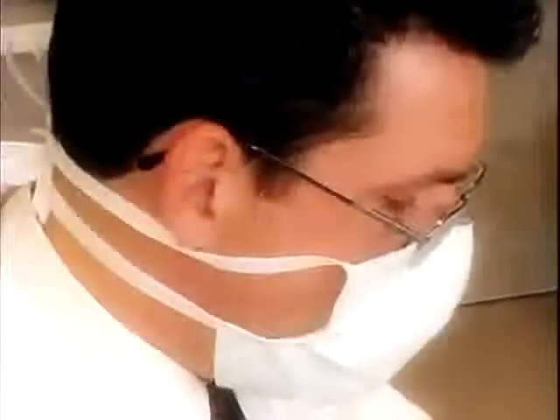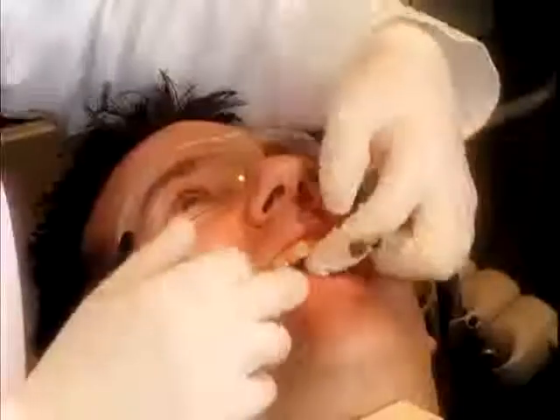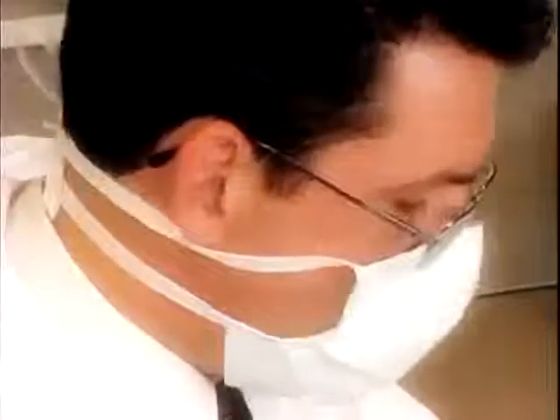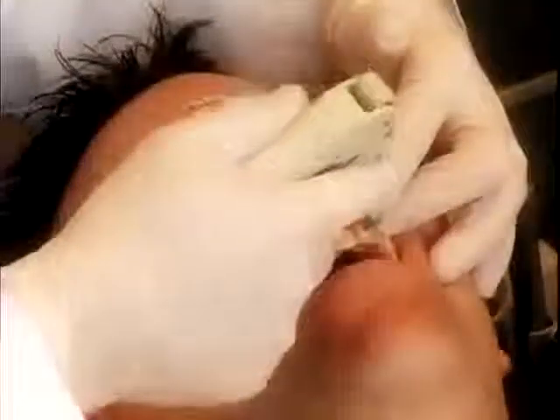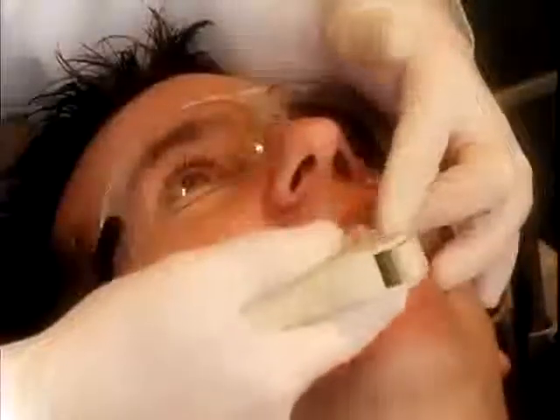You'll note that we're using a lighter color as well, as one of Randy's desires is to increase the coloration to a lighter tone on his teeth overall. We'll be shining a light on the tooth structure and continuing with the next tooth. This procedure continues until the smile is complete.